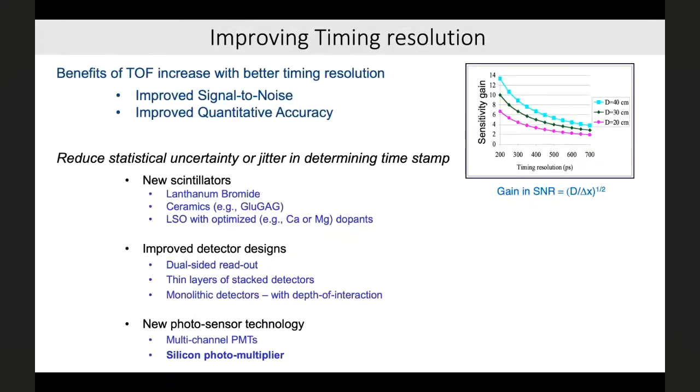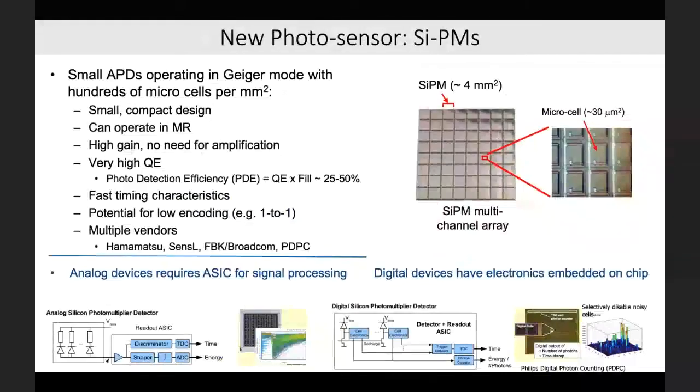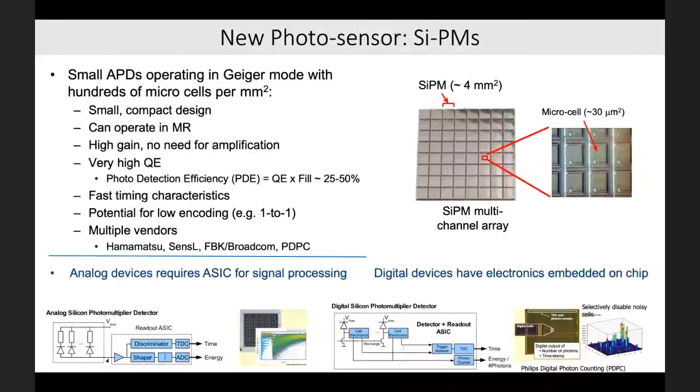What I wanted to mention here, because it is more in the commercial regime right now, is the introduction of new photosensor technology, moving from the traditional photomultiplier tubes to solid state silicon photomultiplier tubes. So very, very briefly, this looks like a lot of technical information, but I think it can give you an appreciation that these silicon photomultipliers can be made quite efficiently and very compact. And so the picture that you're seeing on the right is an 8x8 array. So it's 32 millimeters by 32 millimeters, but it can now have 64 channels. And that was very difficult, if not impossible, to achieve in such a package with a vacuum tube photomultiplier.